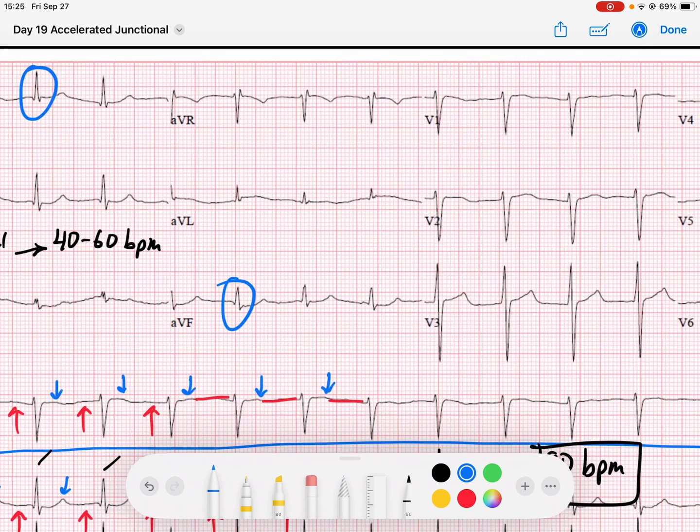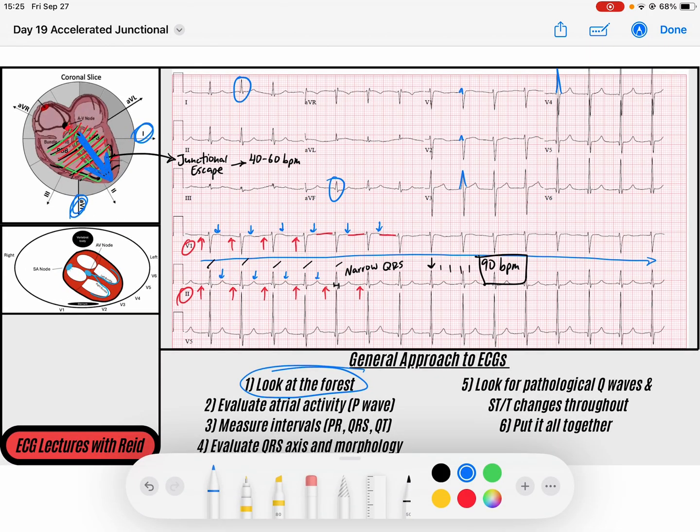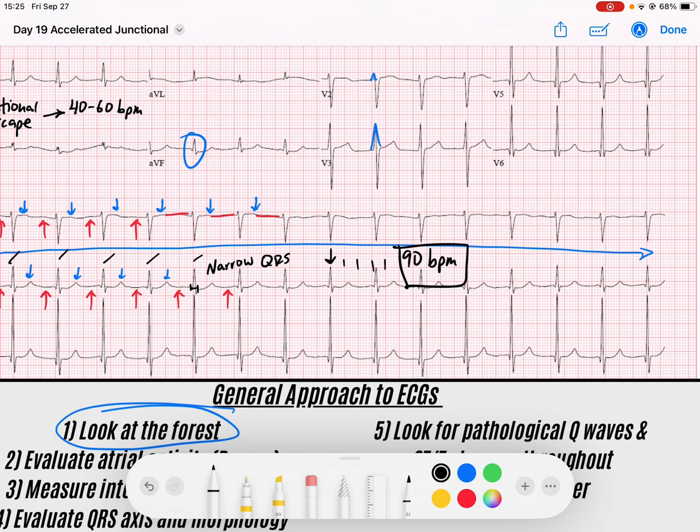I've got nice septal R waves that grow and become dominant in V4, so this conduction system looks really good. My QT intervals look great, I don't see any pathological Q waves, no acute ischemic changes. What's actually happening here is we're just having a junctional rhythm that is accelerated, because it's going faster than what a junctional rhythm usually is. Usually it's a junctional escape, but because it's faster at 90 beats per minute, we would call this an accelerated junctional rhythm.